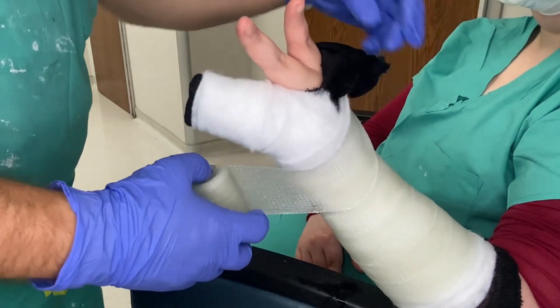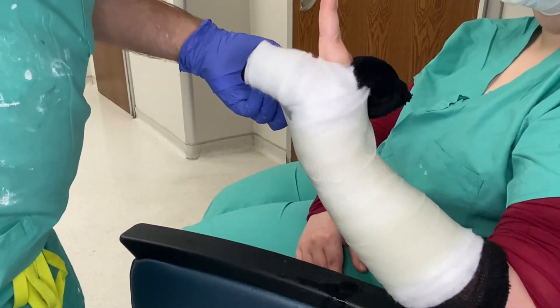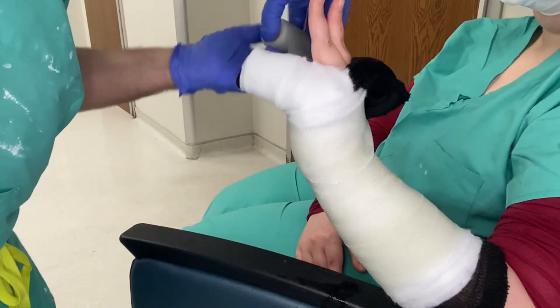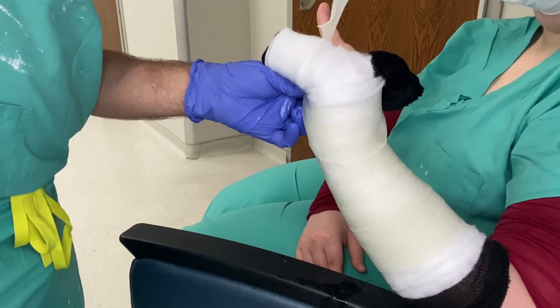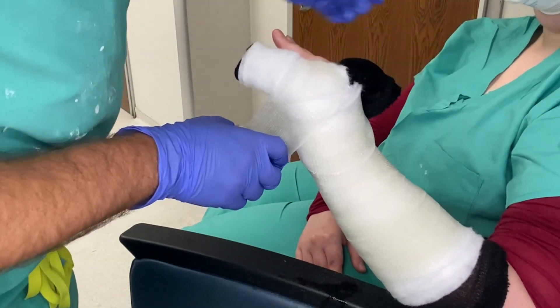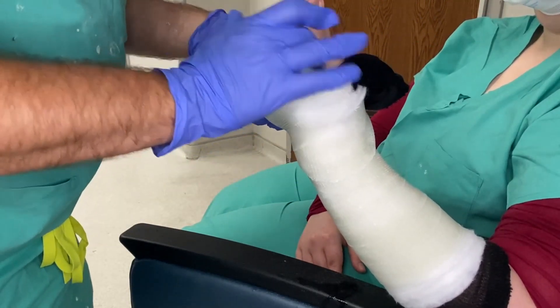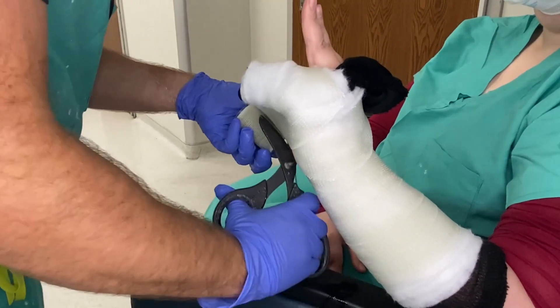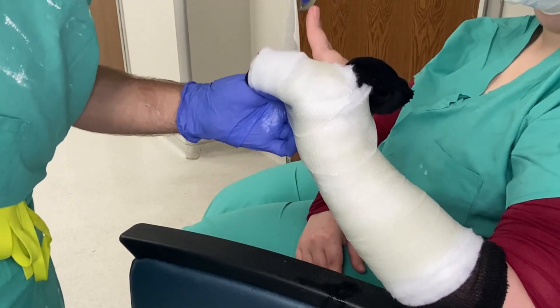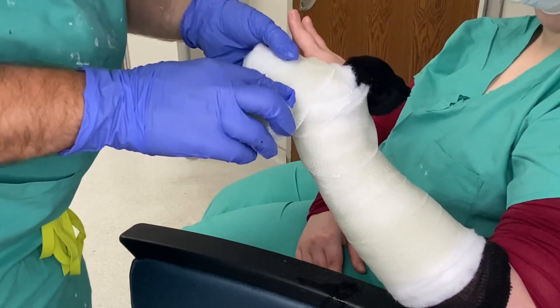Now do something different — go right up to the fingers, coming up 50-50. Do almost a three-quarters cut, or a little more if needed, then do a 180-degree twist and a corner fold. Notice how it's nicely layered. Make sure you don't come in too tight between the fingers — you want them nice and free. Build it up with another half cut, corner fold, twist, tucking all the little edges in, and go back to 50-50.